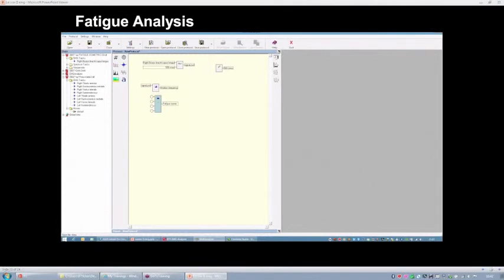So to compute the fatigue, you have some different options in our EMG analyzer application. The block I'm going to use is specific for the computation of fatigue in isometric contractions. In this case, the first input has to be the raw signal, and then you have to define the two events which define the signal portion that you want to analyze. So I'm going to define the start and the stop of the time window with respect to which I want to analyze the signal.